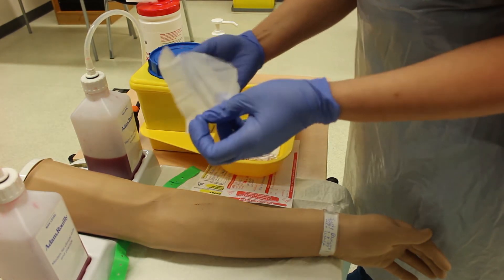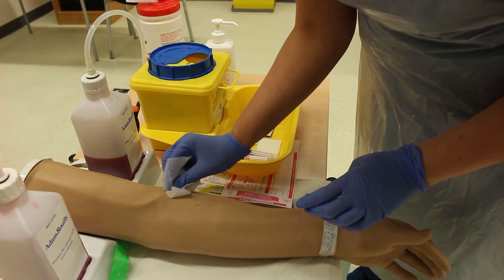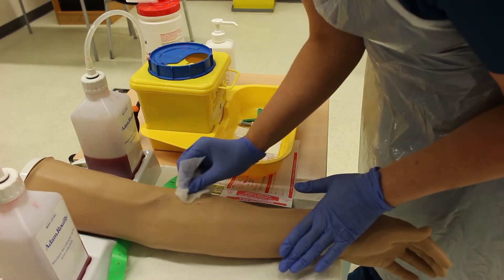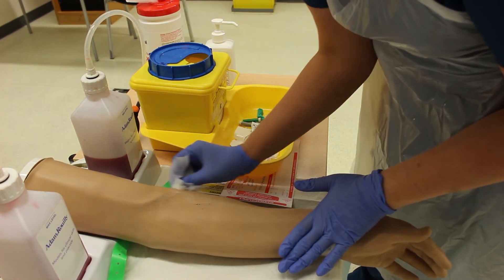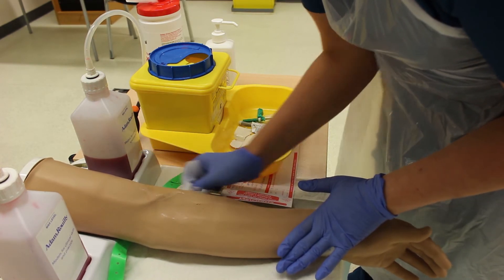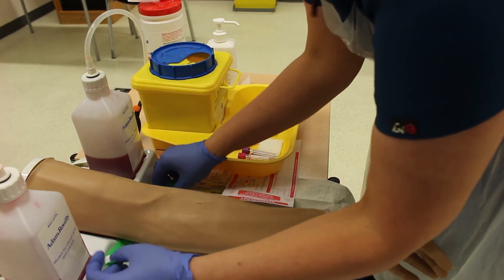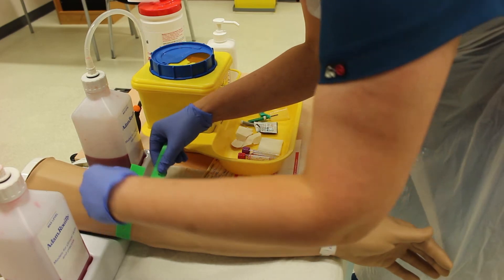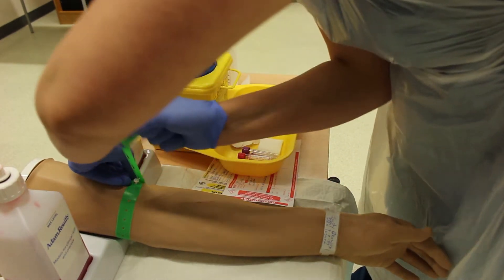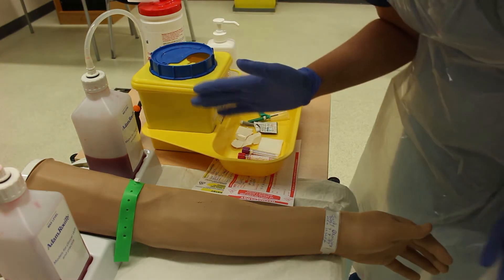I have a new pair of gloves on. I'm going to clean the site with a 70% alcohol wipe — opening it up and using non-touch technique, starting at the point of intended needle insertion and working outward in circular motions. Allow that to dry while re-applying the tourniquet five to six centimeters above the chosen site.